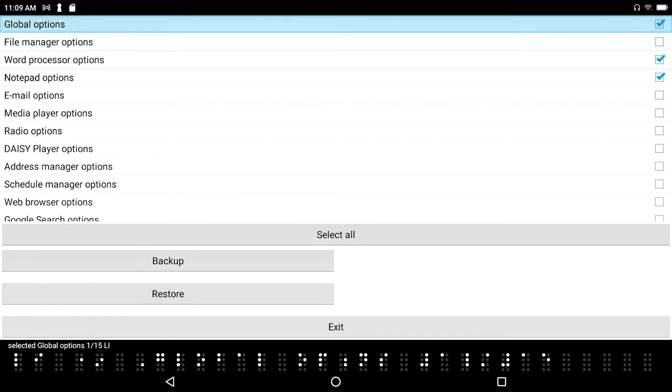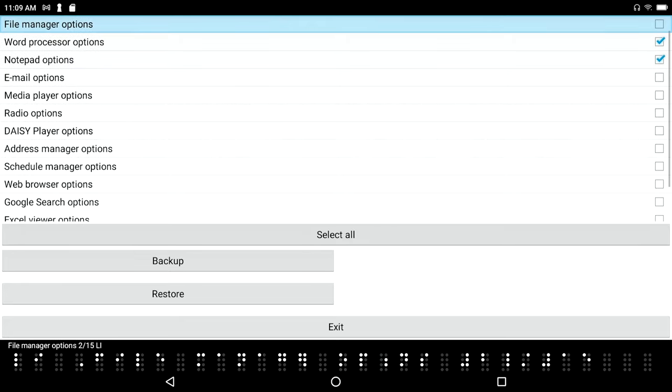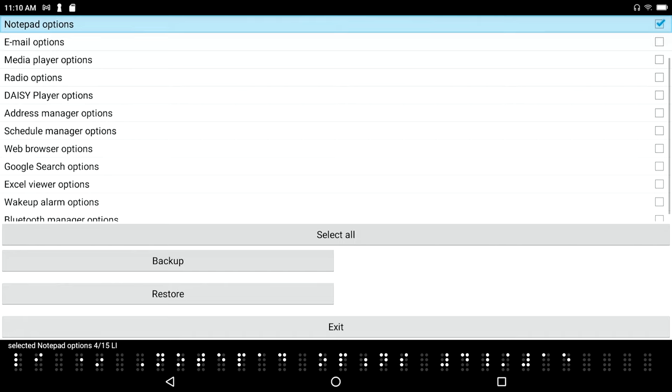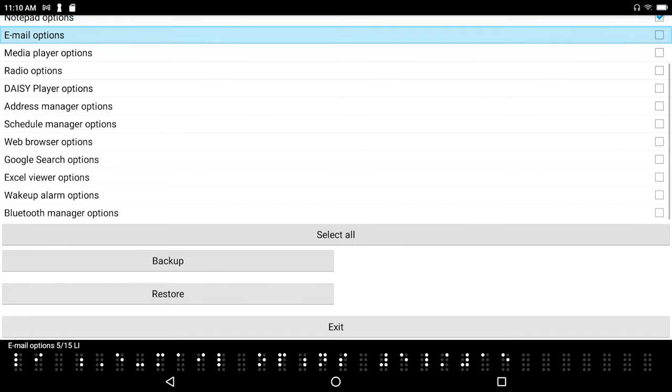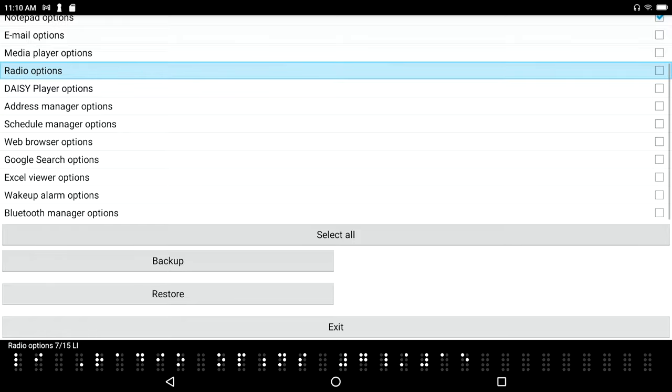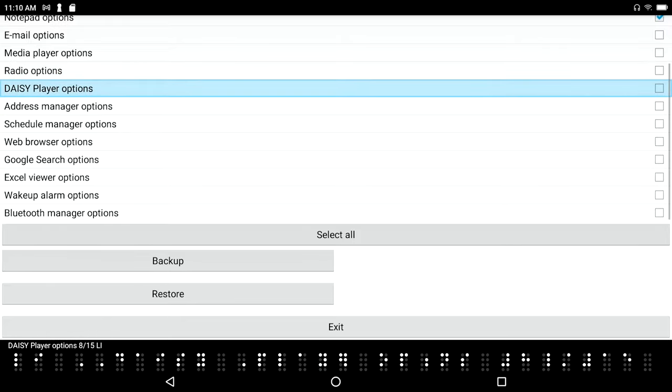I'm going to just basically space dot forward down through this list: file manager options 2 of 15 list items, and we've got all kinds of options in here. Selected word processor options 3 of 15, notepad options 4 of 15, email options 5 of 15, media player options 6 of 15, radio options 7 of 15, daisy player options 8 of 15.